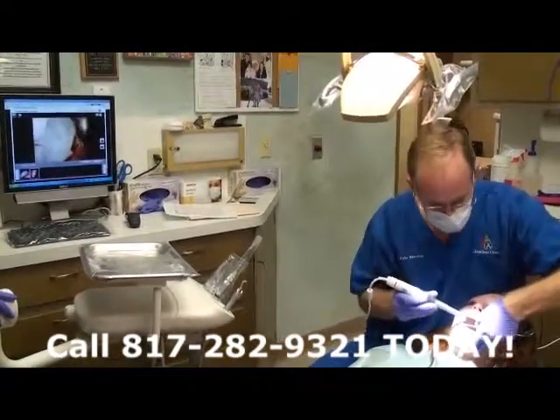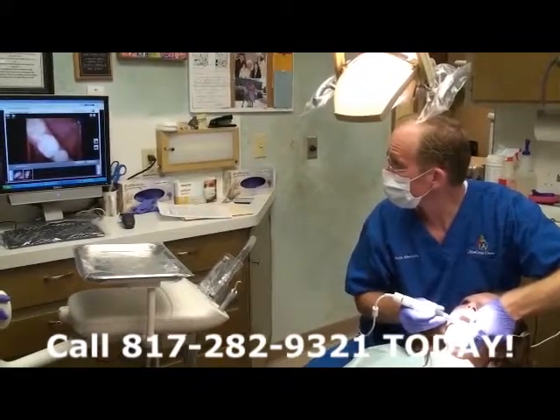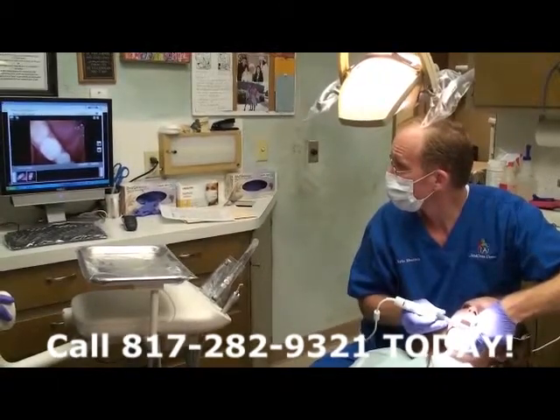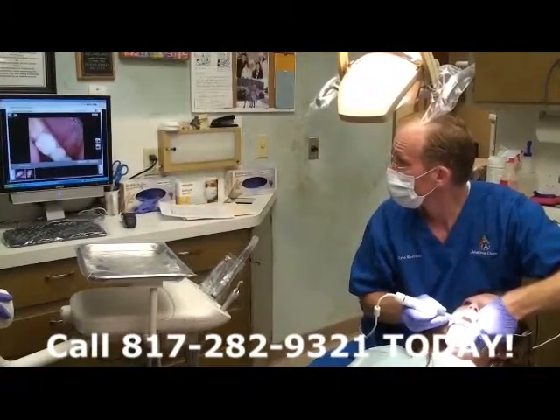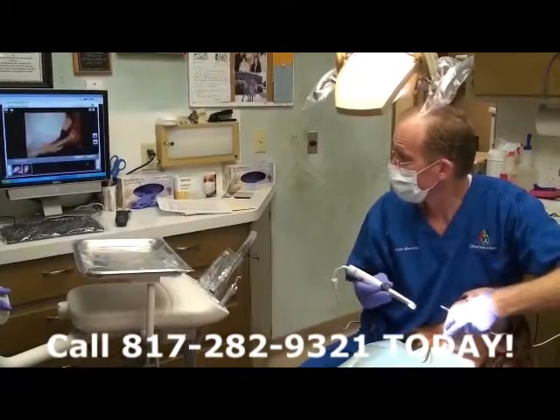So these are some images of the back teeth, just to correspond with the x-rays.